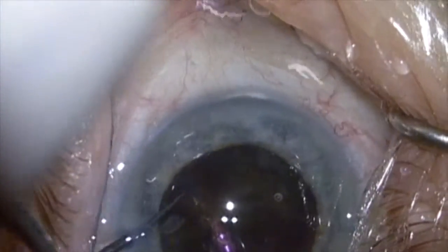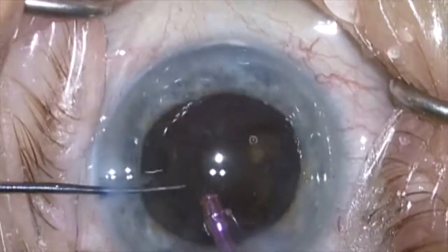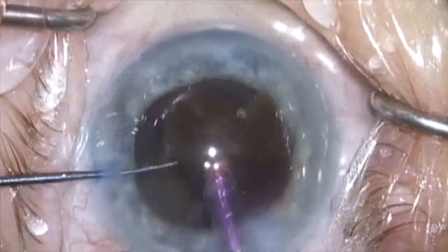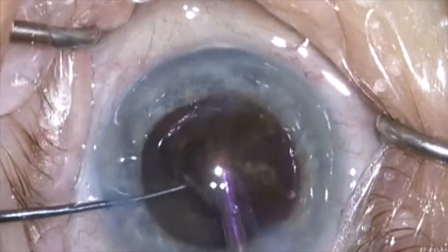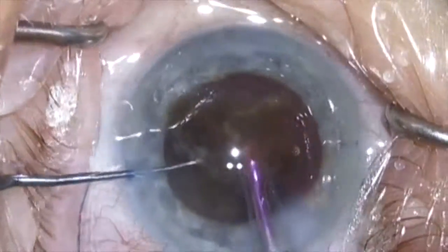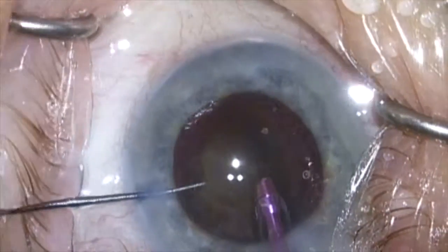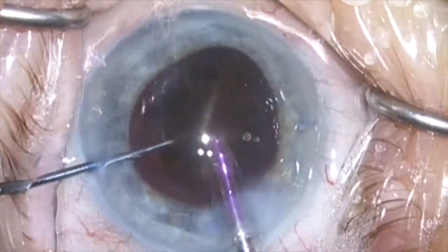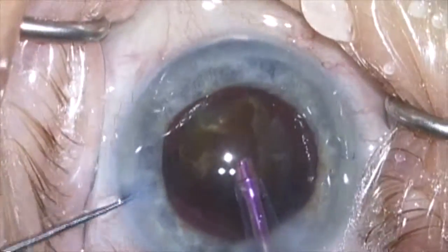It's really a lot of work, but this is a very safe way of handling these dense nuclei. I sometimes like to turn the phaco tip and angle it so that the phaco energy is directed a little bit more posteriorly. You can see that the tip has the bevel down at this point — I've done this a few times during the procedure without calling attention to it.